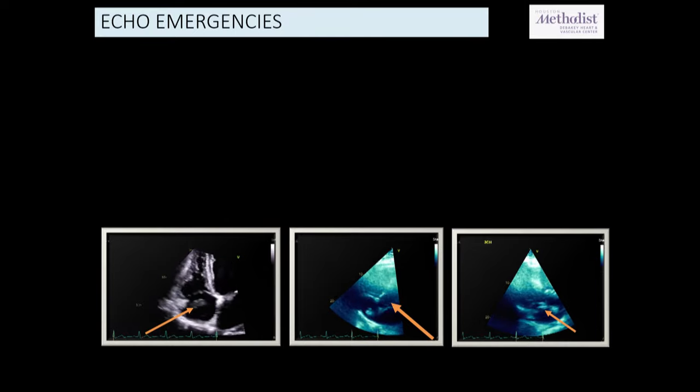You can clearly see, I know, technically difficult images, but definitely that's real life, right? So you don't get crystal clear images all the time. But what's more important is that you see it in the right atrium and the left atrium, right? And it's almost in the interatrial septum. Remember, echo is a dynamic thing, right? So you can actually see events happening in real time too. So you can clearly see that it's going through the PFO, which is that thrombus in transit, and that definitely deserves a call from the echo lab, right?